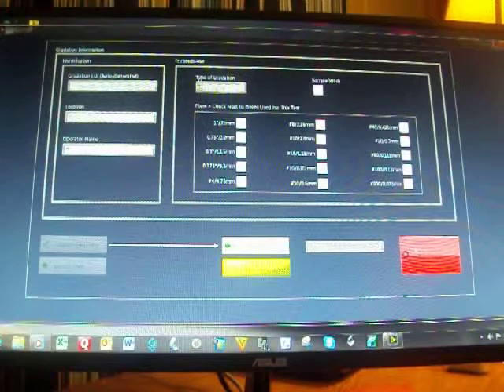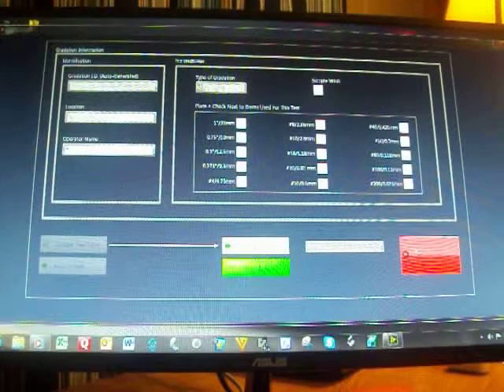We could demonstrate an abort if you want, or just let this play through to the end. Yeah, we'll play it through and then we'll do an abort after. Okay, good. So at this point, there's not a lot to watch, not a lot to do. You can be off doing something else while this is testing.